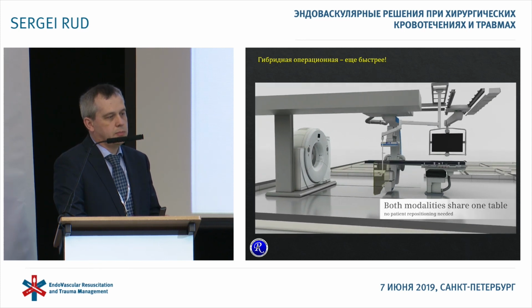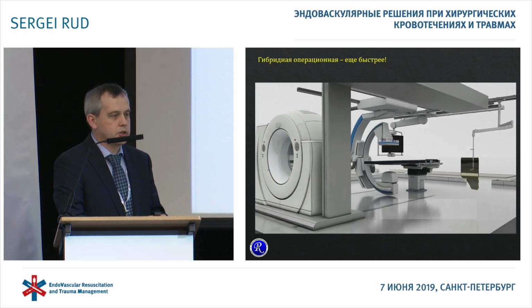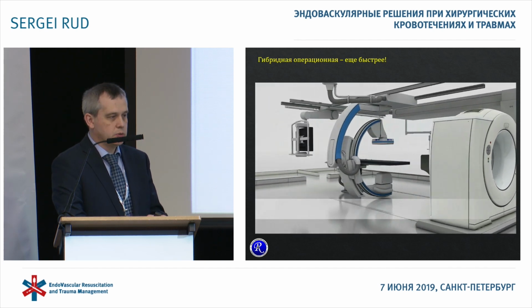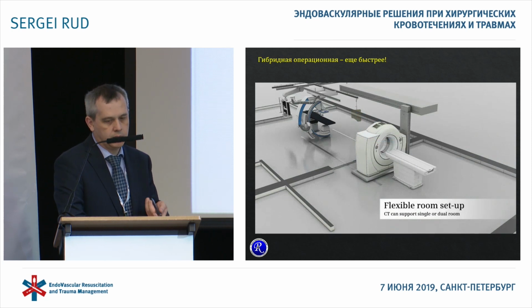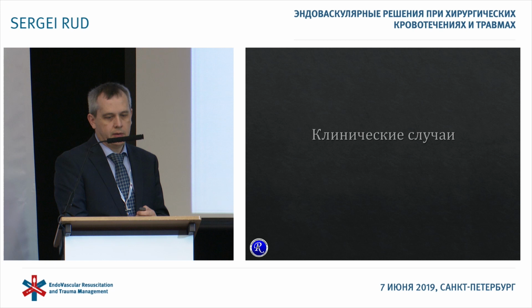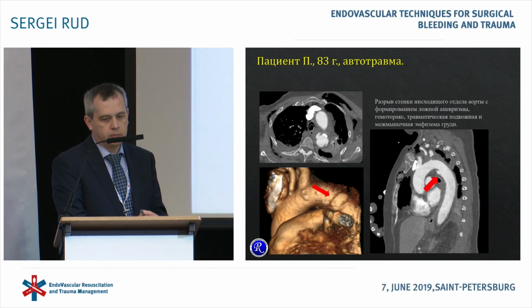What such imaging gives us is the quickest study. Usually this is a sliding gantry that allows us to speed up the study, and the flexible table. So all of these systems are really justified to be used in practice.